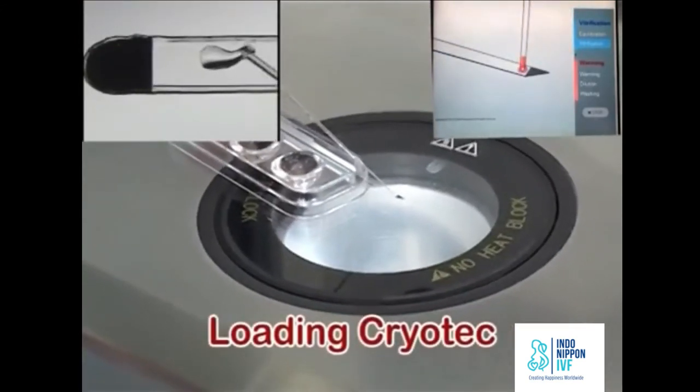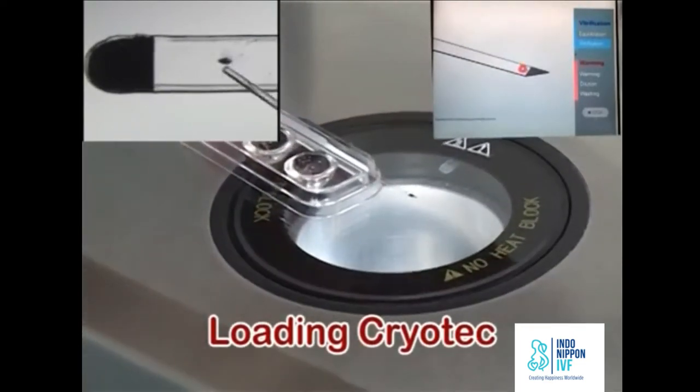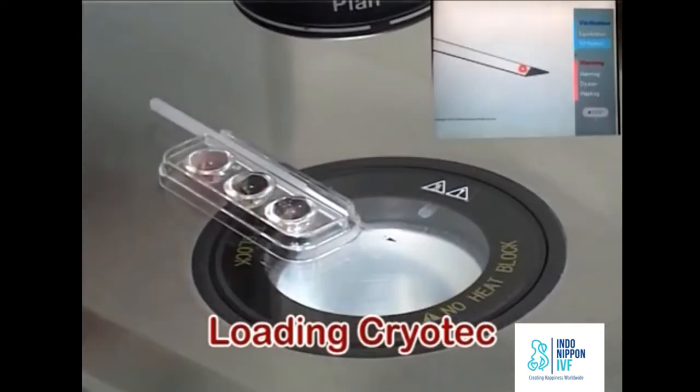Get the cryotech tip under the microscope. Place the oocyte near the end of cryotech sheet with minimal volume of VS-2. One oocyte per droplet is recommended.